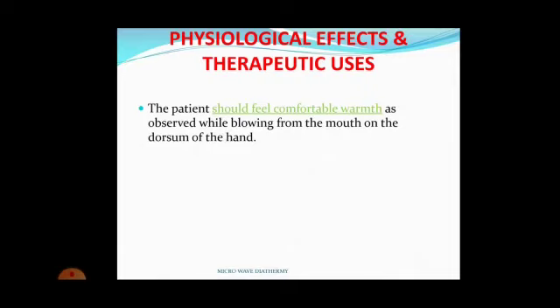Okay, how much? For example, if you are blowing from your mouth on the dorsum of your hand, the amount of heat you feel there is the same amount of heat the patient should feel whenever microwave diathermy is given. Many patients believe that if they feel more heat they will be cured earlier, but that is not true. It should be just comfortable warmth, that's it.